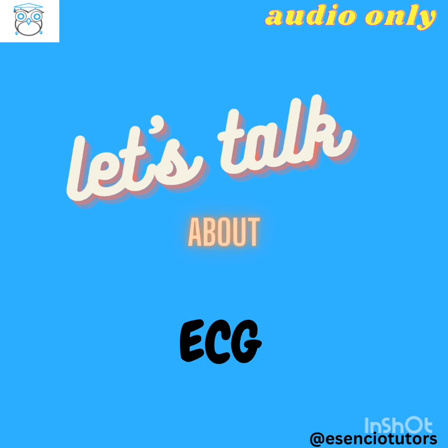Yeah, that's the name, right? Multifocal atrial tachycardia. Multifocal, multiple locations in the atria.